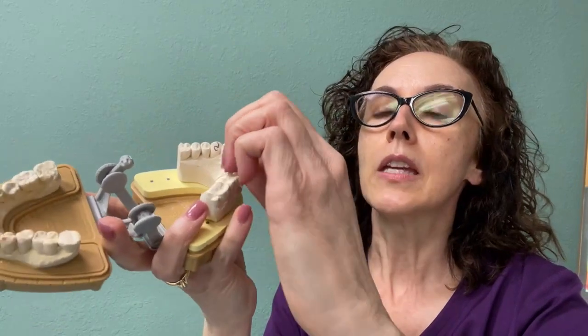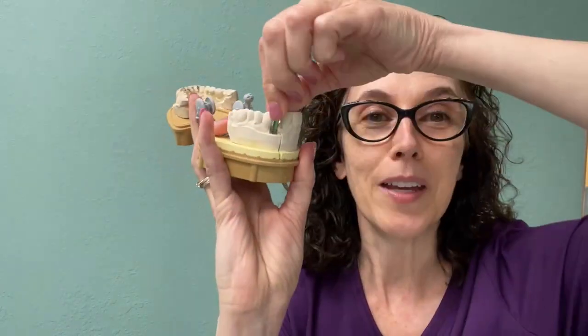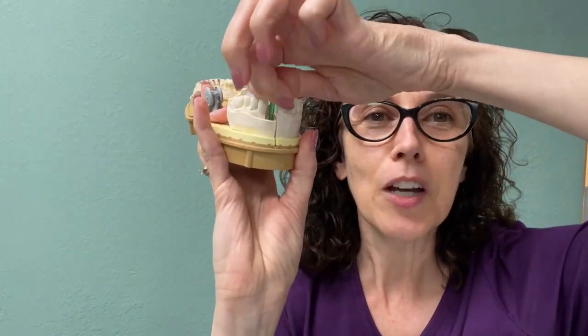So at this stage, the patient would come into our dental office and be ready to have it restored. What we would do is to put something in called an impression coping. And when you put that impression coping into position, it just kind of screws right into place. Pretty neat. And it sticks out further than all the other teeth there. And then we would take an x-ray and make sure that it's in its right position, and then take an impression. And that's the information that would go to a laboratory.